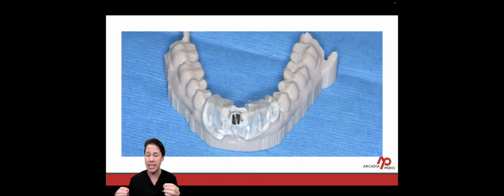Other benefits to DTX Studio are you can create surgical access windows if you wanted to for a larger guide. You can put initials, right? We can put Arcadia Perio right here if you have a lot of guides that you're doing. All of this software communicates directly with SprintRay. If you want to see how that digital workflow works, jump into my Modern Periodontal Concepts module, and you'll get to see a general digital workflow overview.